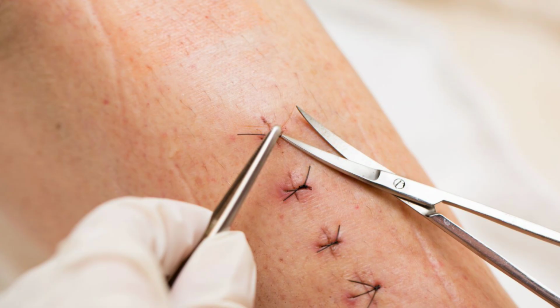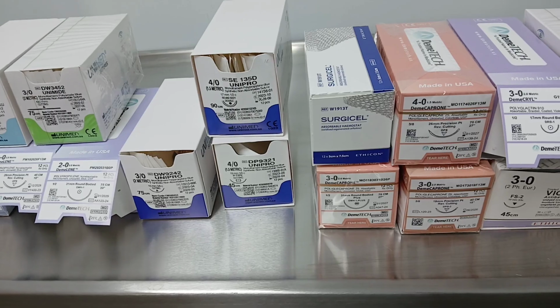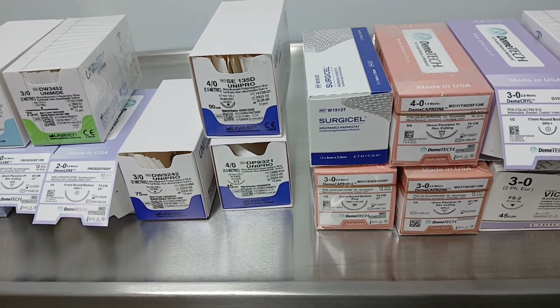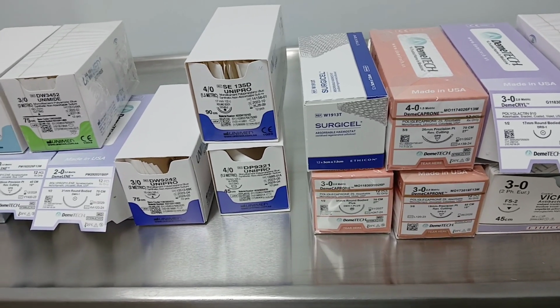Non-absorbed means the suture material is not absorbed into the human body. The patient has to come for the suture removal. That is the meaning of non-absorbed suture. According to the patient's surgery and skin condition, the doctor will select either absorbed suture or non-absorbed suture.